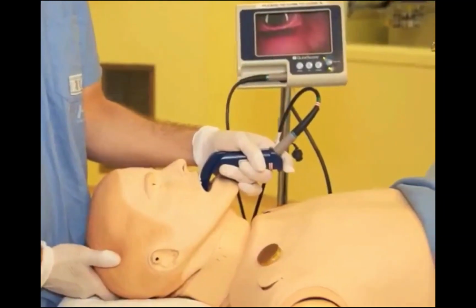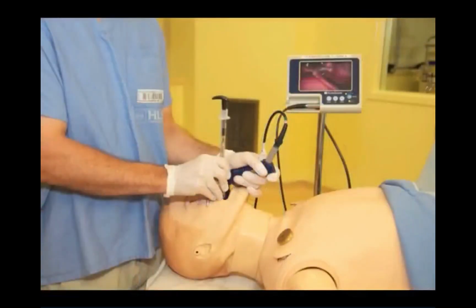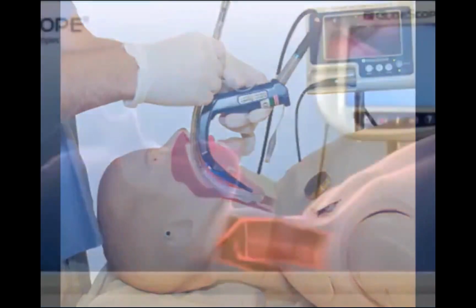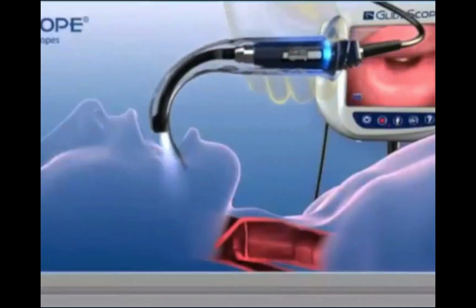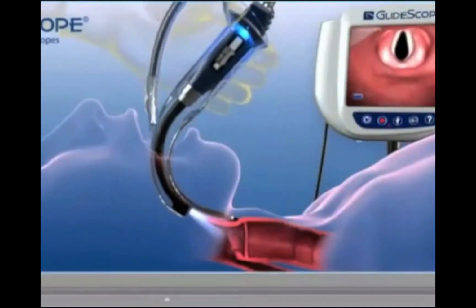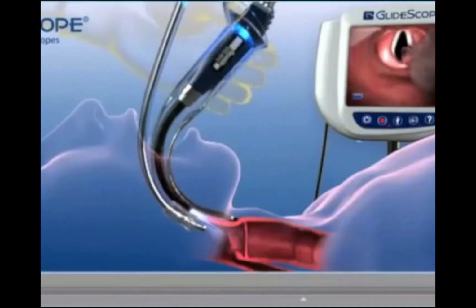The third step is to look directly into the patient's mouth as the styleted endotracheal tube is placed into the posterior pharynx. The fourth and final step is to look at the Glidescope monitor to align the tip of the tracheal tube with the glottic opening. Once the tip of the tracheal tube is aligned with the glottis, the stylet and tube are advanced together into the tracheal lumen. The stylet is then removed and proper tube placement is confirmed with direct visualization of the tube passing between the vocal cords, capnography, and bilateral auscultation of the chest.